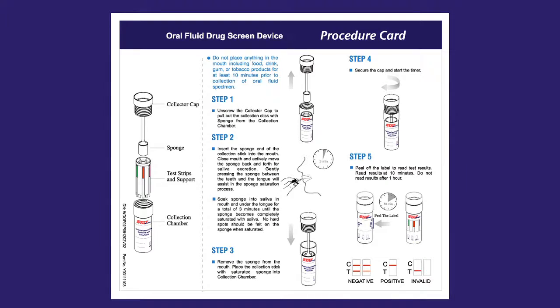In this video, you will learn and observe the advantages of the test, how to store and administer the test, how to interpret test results, how to document test results, and what to do when confirmation is needed for preliminary positive test results.